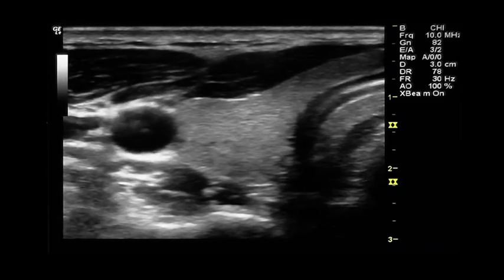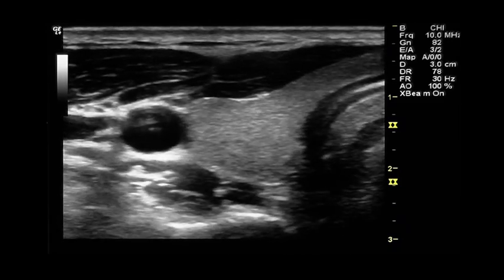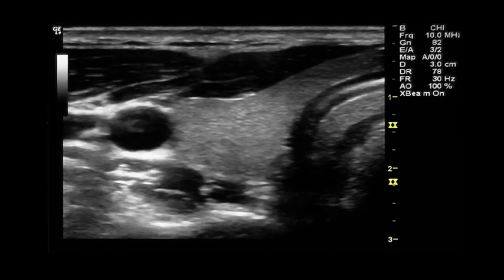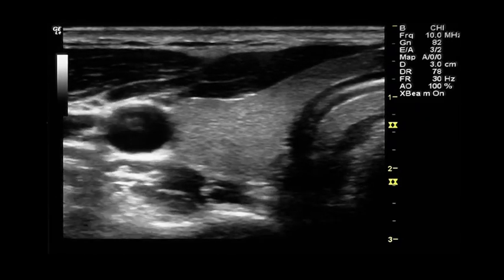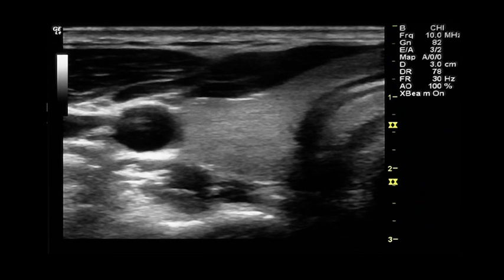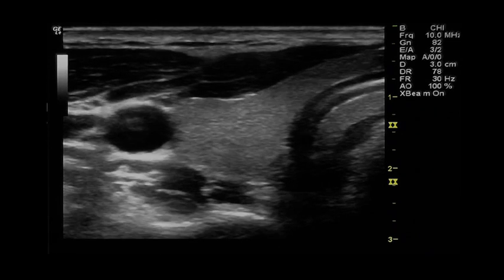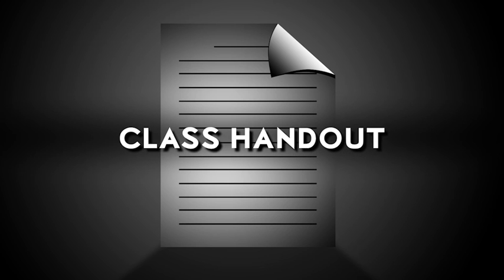Shift the position of the probe so that it is slightly to the right of the midline. Bring the right lobe of the thyroid to the center of the screen and obtain an optimal mid-transverse view. Consult the class handouts for directions on how to submit images once they have been obtained.